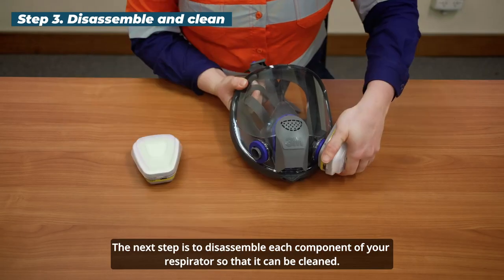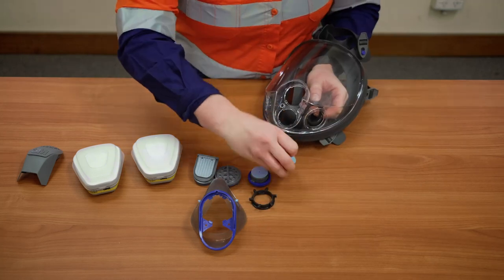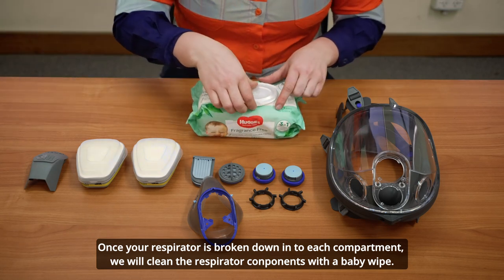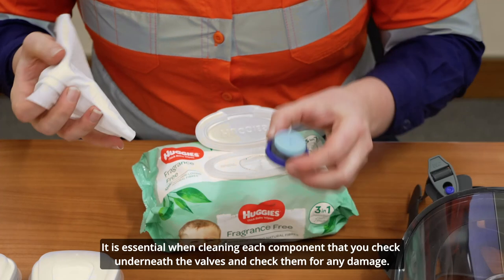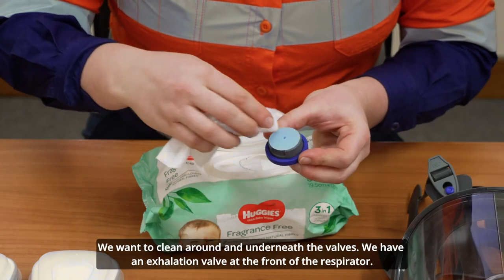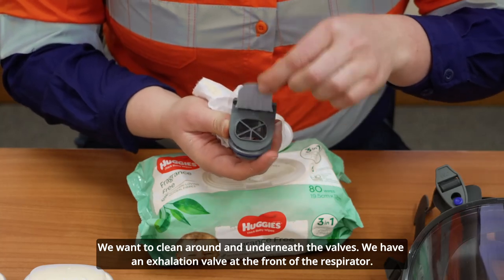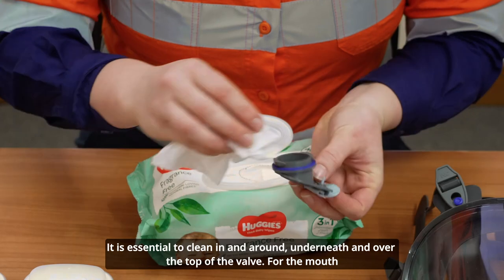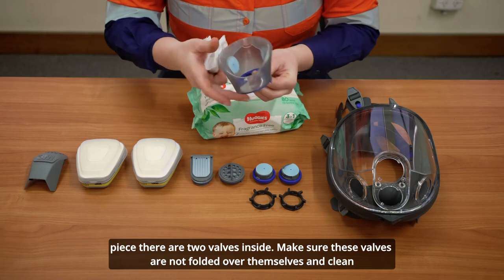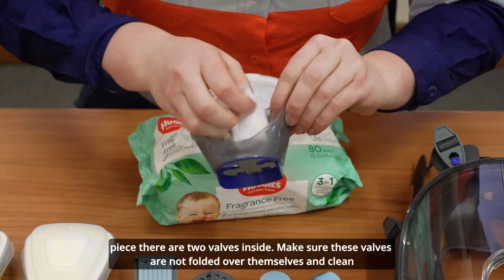The next step is to disassemble each component of your respirator so that it can be cleaned. With the respirator broken down, clean the components with a baby wipe. When cleaning each component, check underneath the valves for any damage and clean around and underneath them. The exhalation valve at the front must be cleaned in and around, underneath and over the top. For the mouthpiece there are two valves inside — ensure they are not folded over themselves and clean in and around each part.